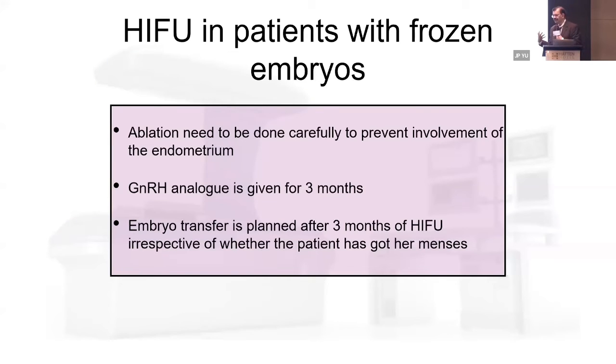I've been doing it for about a year, and in the earlier cases that I was doing HIFU for adenomyosis, I was telling them, okay, let's wait for your periods. When your period comes, then we will do the embryo transfer. And what happened? The uterus starts growing back after completion of the HIFU treatment, because we know that in adenomyosis, when you're doing HIFU, we will be maybe doing 60%, maybe 70% if we are lucky.